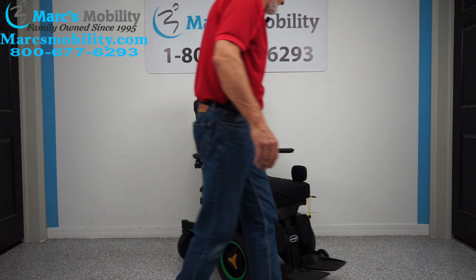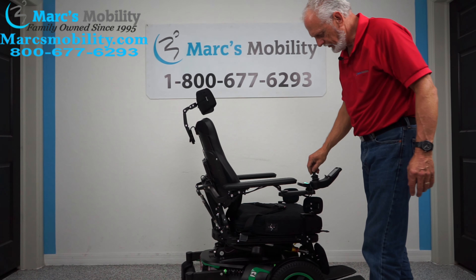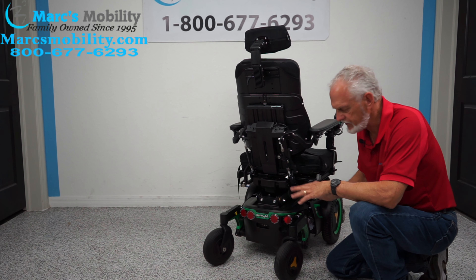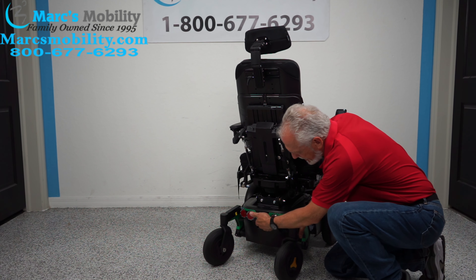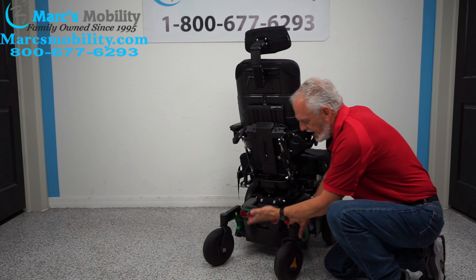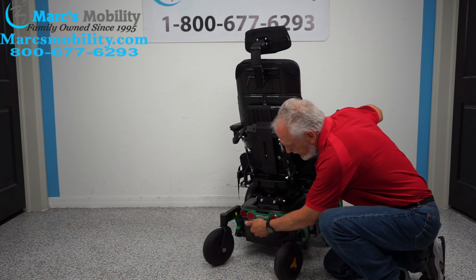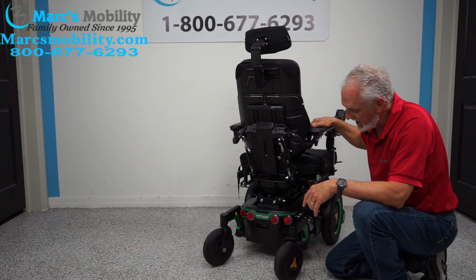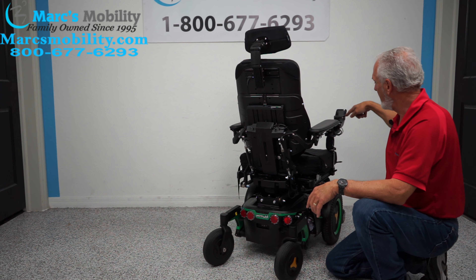The back of the chair has a fully adjustable headrest with lots of adjustments. Also back here — when we ship these chairs, we always turn the main power off. There's a hole in the back of the chair with a button on top inside. I just turned it off — all power is off. So when you get your chair, you have to go in here, find the button on top — it's a heavy-duty switch. Then you can turn your power back on up front.